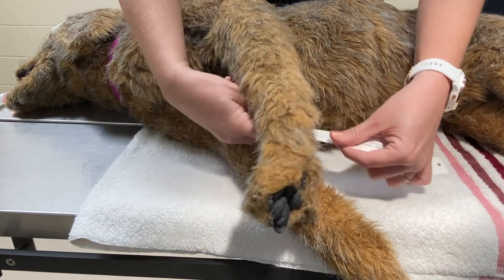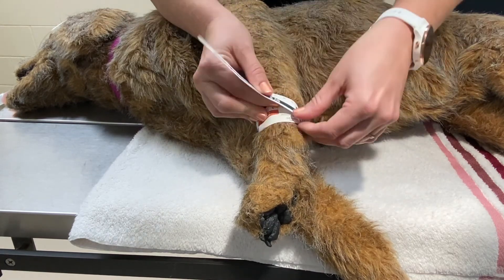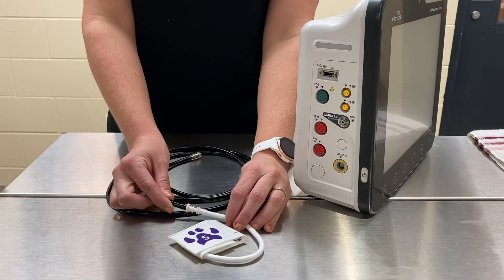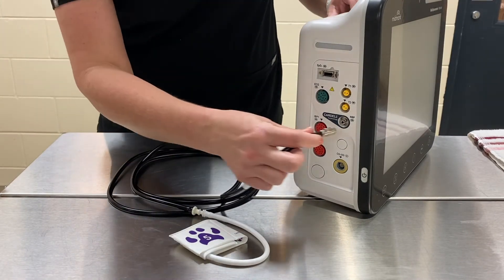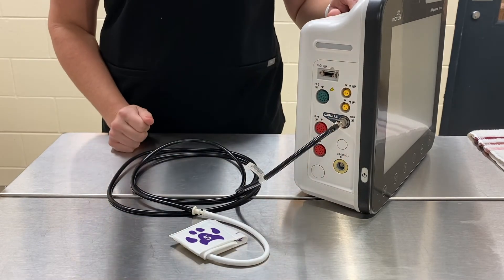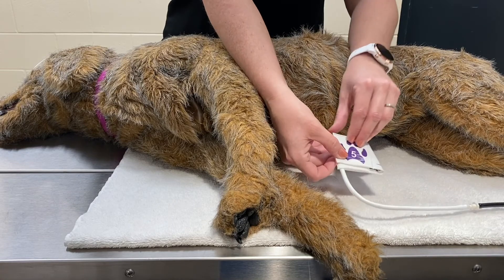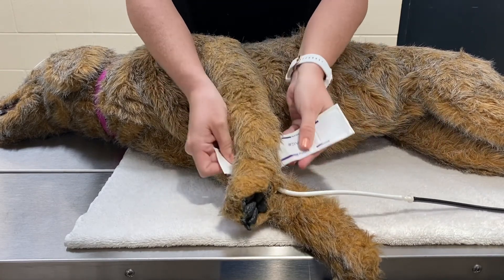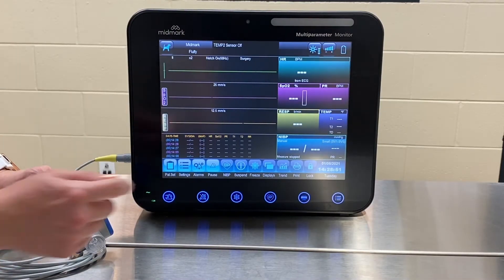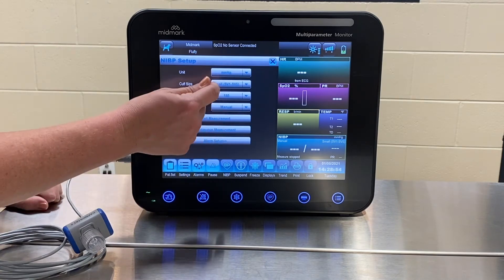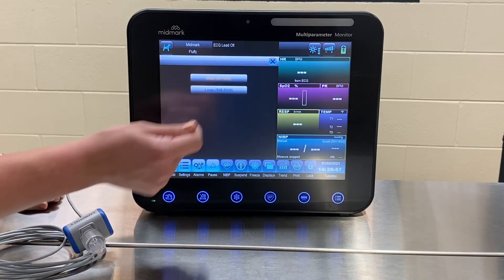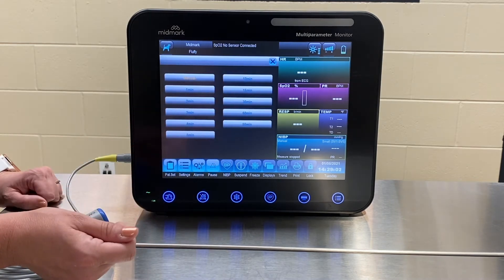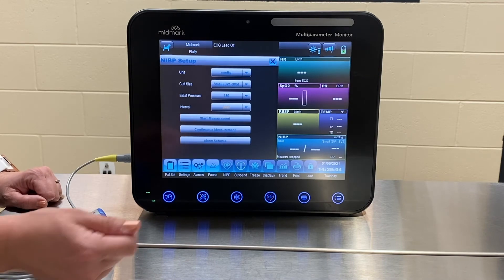To determine the correct cuff size for blood pressure readings, measure your patient's limb with the provided cuff selector. Connect the cuff to the blood pressure hose and plug the hose into the NIBP port on the monitor. Place the cuff snugly around the patient's limb in the same horizontal plane as the patient's heart. Open the NIBP menu by pressing the numeric area and set cuff size using the small setting for cuffs 1 through 5 and large setting for cuffs 8 and 10. The interval setting can be used to take automatic readings at desired time periods.